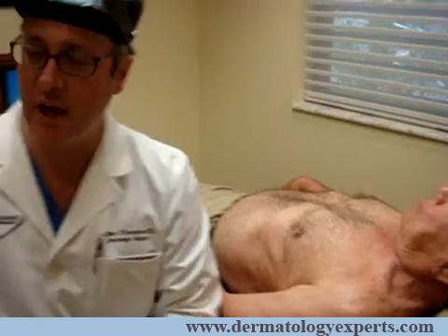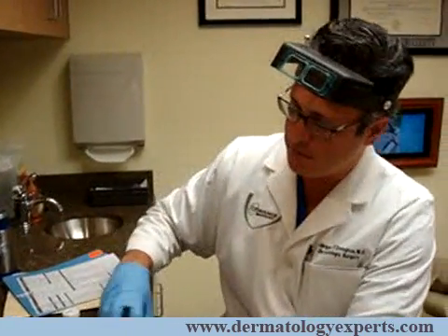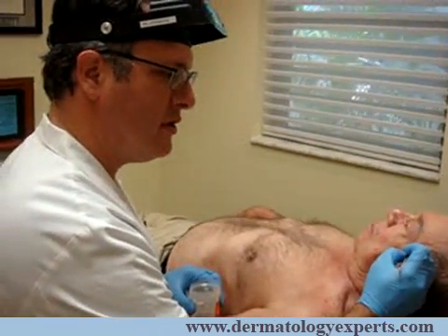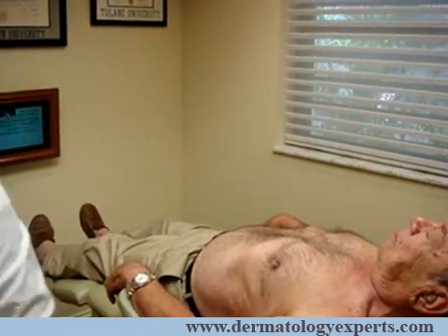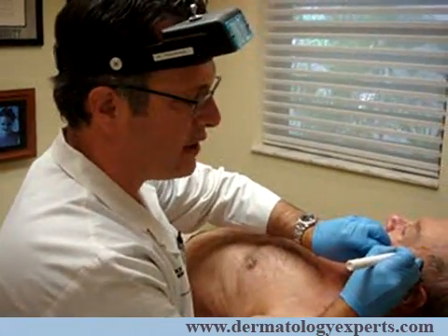Always labeling the bottle. Then I'll use just a little bit of aluminum chloride, which is a solution that coagulates those little blood cells. And then I'll use a handheld cautery device just to cauterize that lesion there.